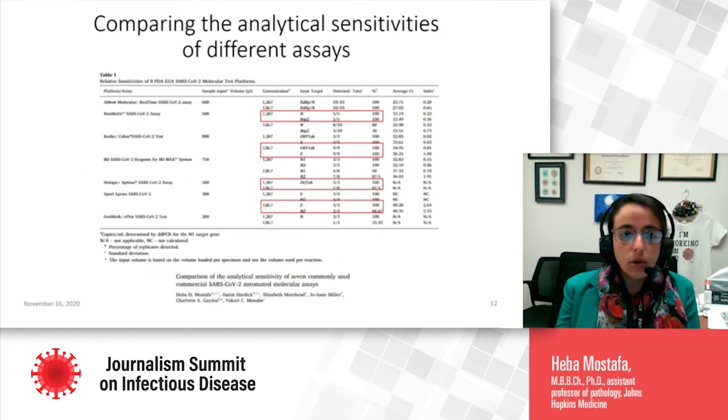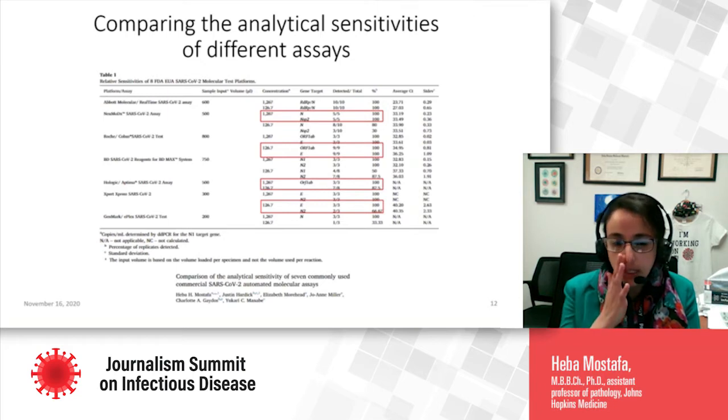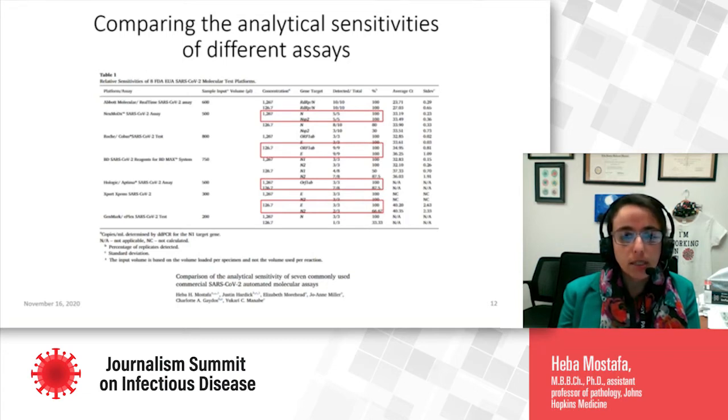Then as we offered additional platforms, we expanded our comparative studies, but with a different strategy now that we have available specimens and positive specimens that we can use for comparison. We were successful in quantifying one specimen and testing it across the different platforms we have to also show that our assays offer close sensitivities and also excellent sensitivities.